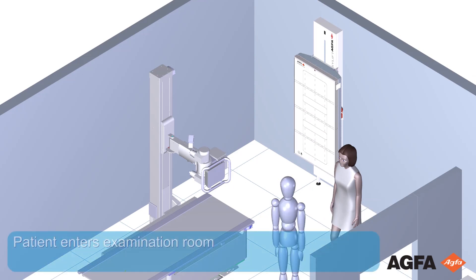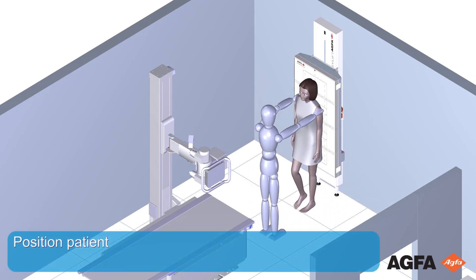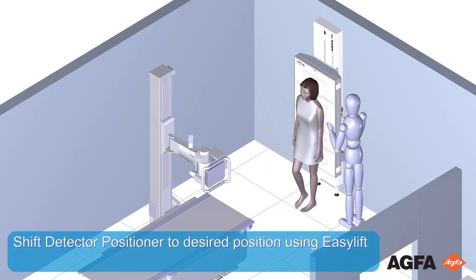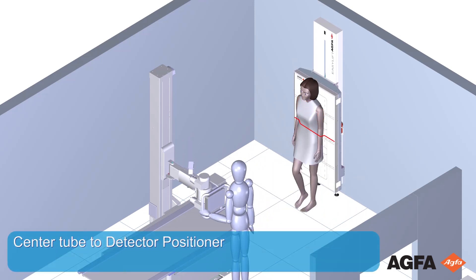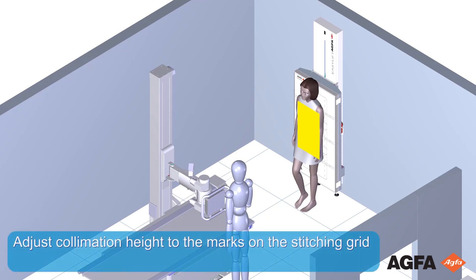The patient enters the examination room. Position the patient in front of the detector positioner. Shift the detector positioner using the EasyLift to fit the desired region of interest. Center the tube to the detector positioner. Adjust collimation height to the marks on the stitching grid. Adjust collimation width.